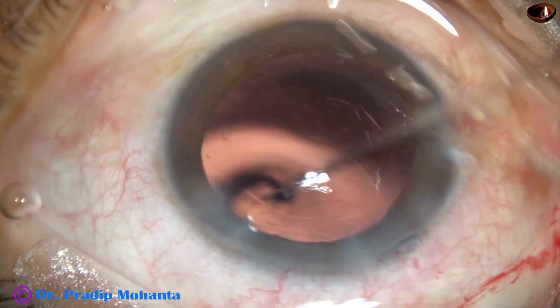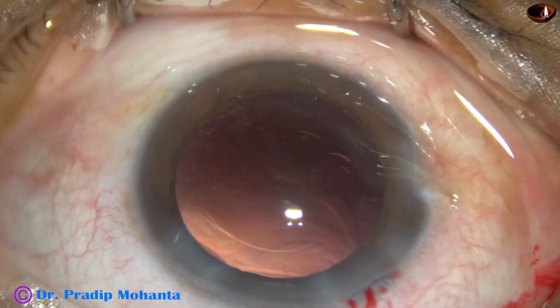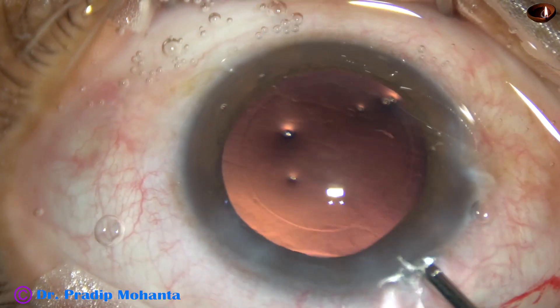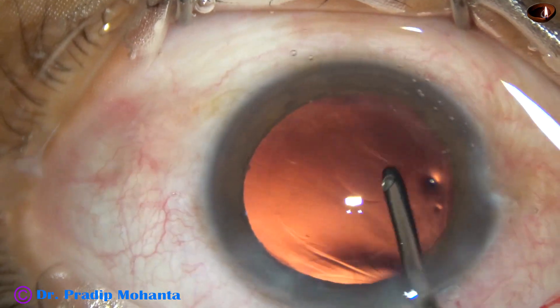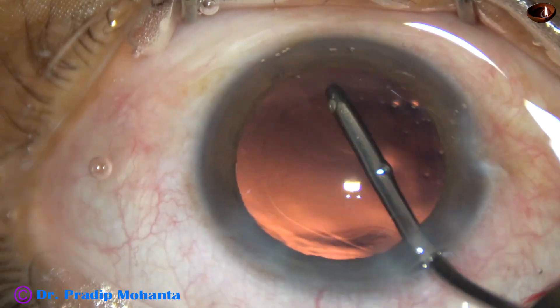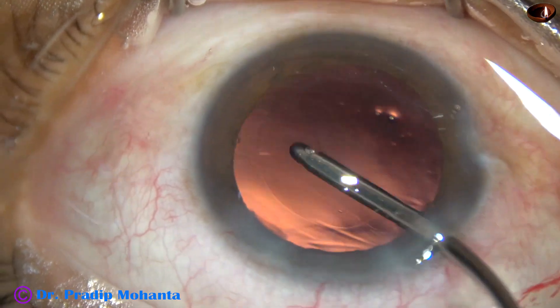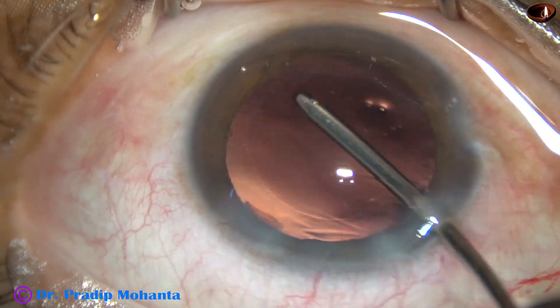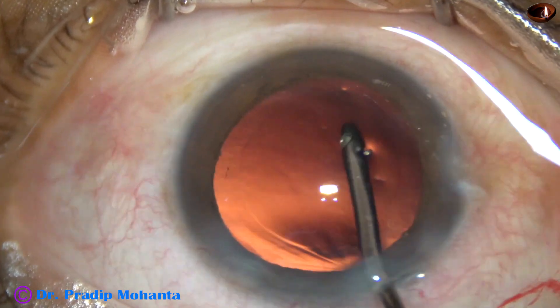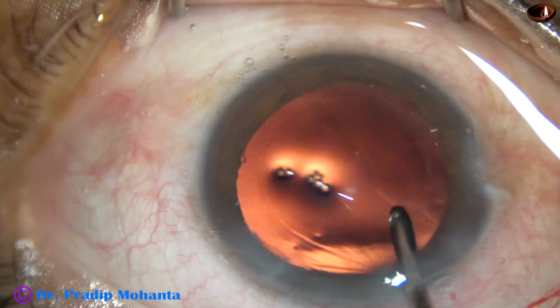Some lens epithelial cells and lens fibers are attached to the posterior capsule. I am using irrigation to dislodge these lens epithelial cells from the posterior capsule — we can call it hydro-polish: polishing of the posterior capsule with BSS, balanced salt solution. The posterior capsule has been nicely polished.